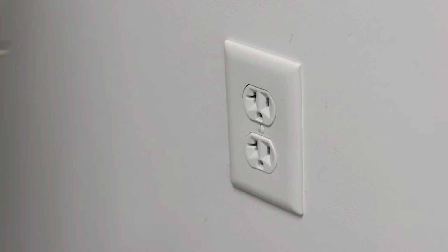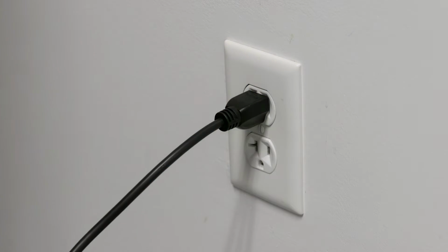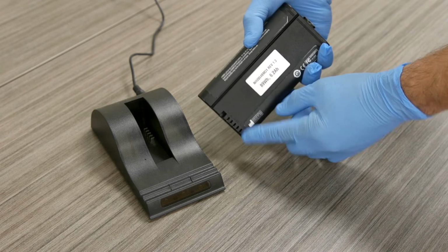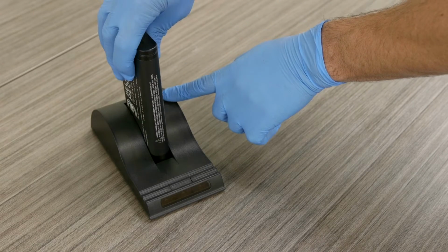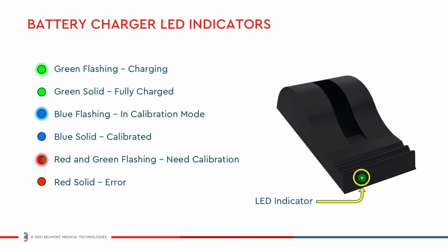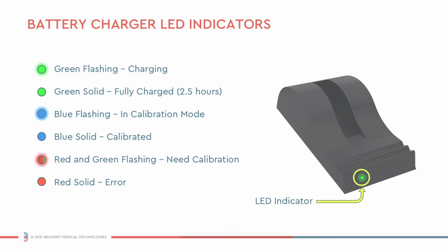To charge the battery, first connect the charger to a power source and place it on a flat surface. Place the battery into the battery charger bay, ensuring that the 5-pin connector is fully seated. The charger will automatically begin charging the battery. LEDs in the charger status window will provide status information. It will take approximately 2.5 hours for a fully discharged battery to become fully charged.